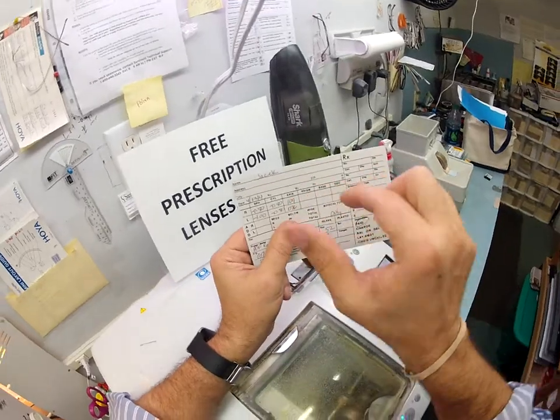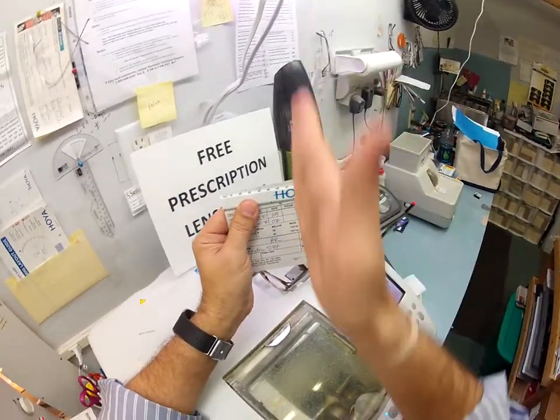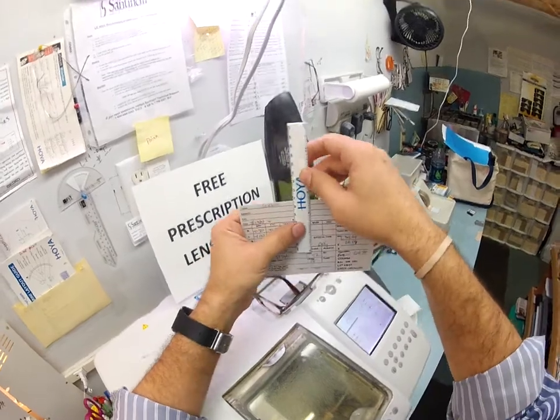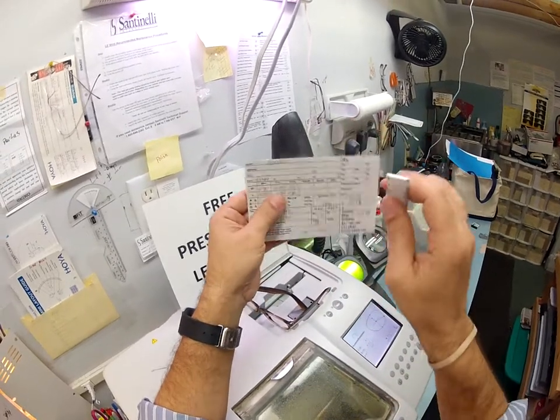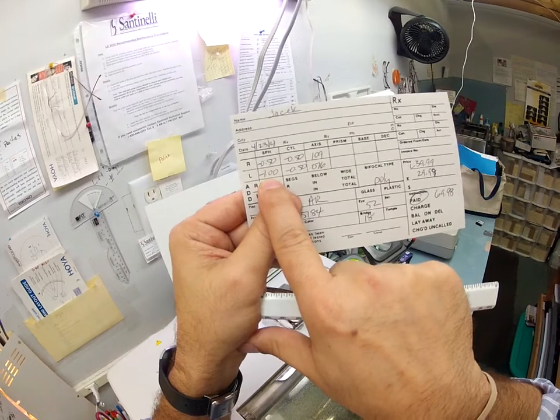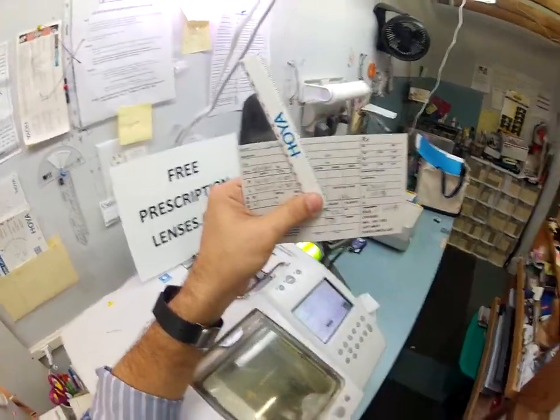The 109 is that fine-tuned knob. If this straight line going across the top of this card was 0 to 180, with 90 and 270 being the vertical meridian, you're at 109. So speaking of 90, 0 to 180, you're about 109. That's where we turn that knob to make everything perfectly clear. Your left eye needs 4 steps of correction at -1, and then you have another 2 steps of astigmatism at 76. So we turn that knob, we would actually turn it to about right there. I'm guessing.